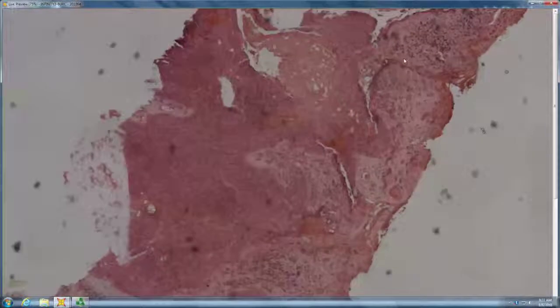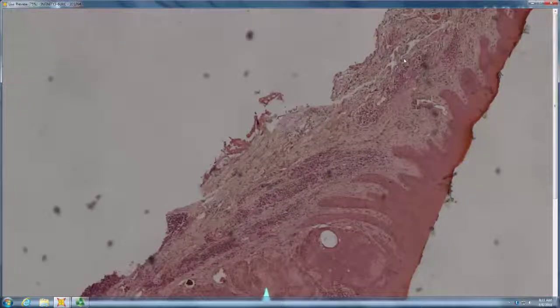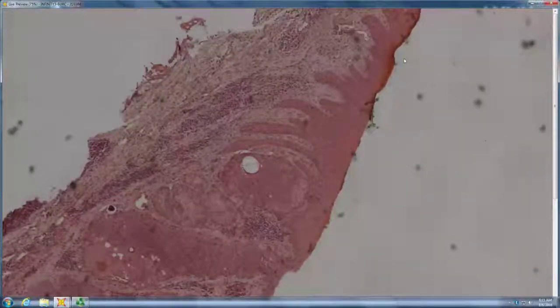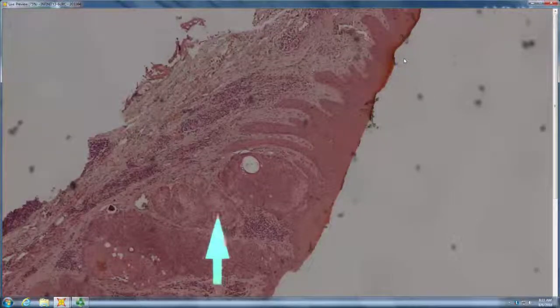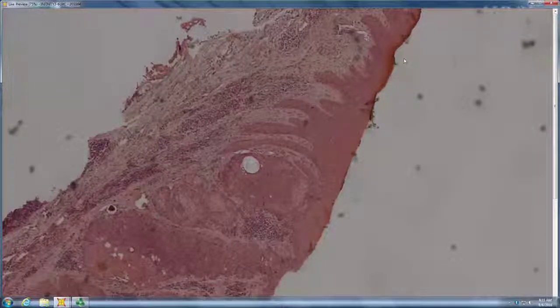Is it another trichoblastoma? It's kind of clear cells. Or is that sebaceous? Looks sebaceous. Okay, so sebaceous epithelioma. Some people may call it sebaceous adenoma or epithelioma. Also because it's bluer and it has red circular ducts, some might call it sebaceoma. As long as you call it benign sebaceous, you're doing pretty well. Yeah, you guys have nailed these pretty well. Well done.